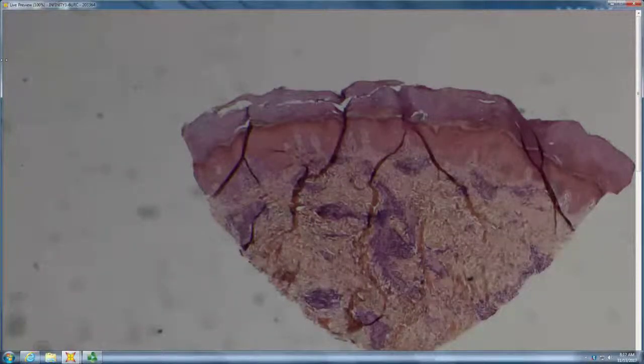And then here you've got the edge of an ulcer. What do you have going on there? So it looks like, is it mucin in there? Yeah, it is myxoid, and then it's just a huge cannonball tuft of vessels, right? I see.